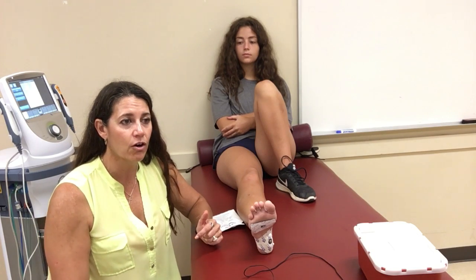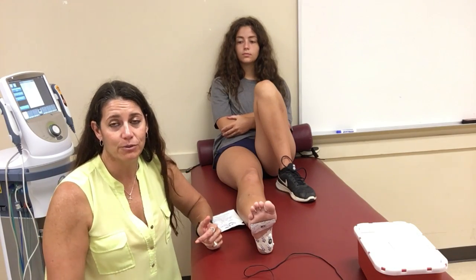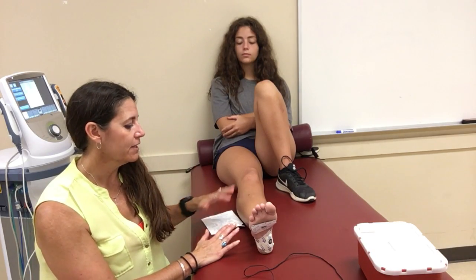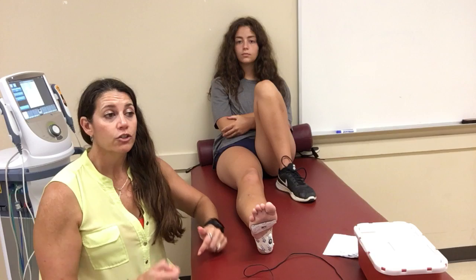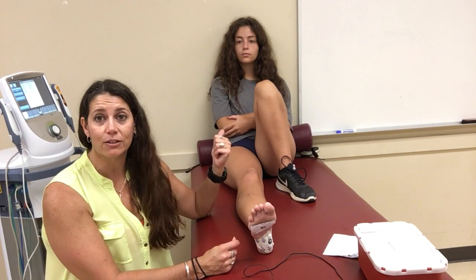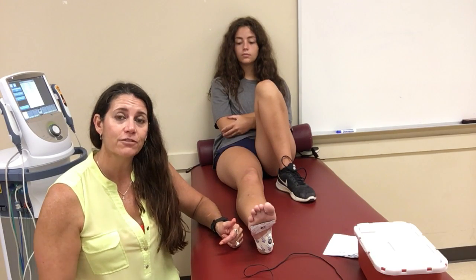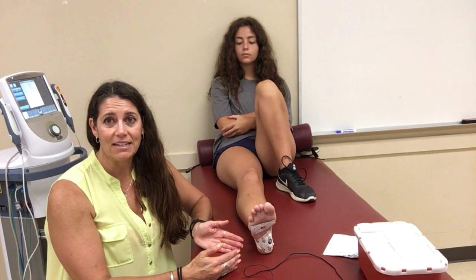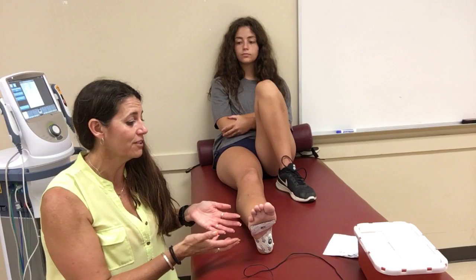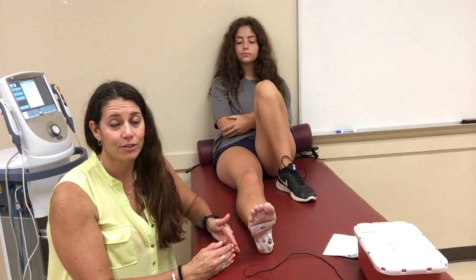If you wanted to target 50 milliamp-minutes and the patient can tolerate 5 milliamps, that's a 10-minute treatment. Keep asking how the patient feels as you increase intensity. If at 3 or 3.5 milliamps they say it's too painful, you need to readjust the time to still reach your target dose. Sometimes you have to figure it out on the fly because the patient may be more sensitive that day. This is not a daily treatment.